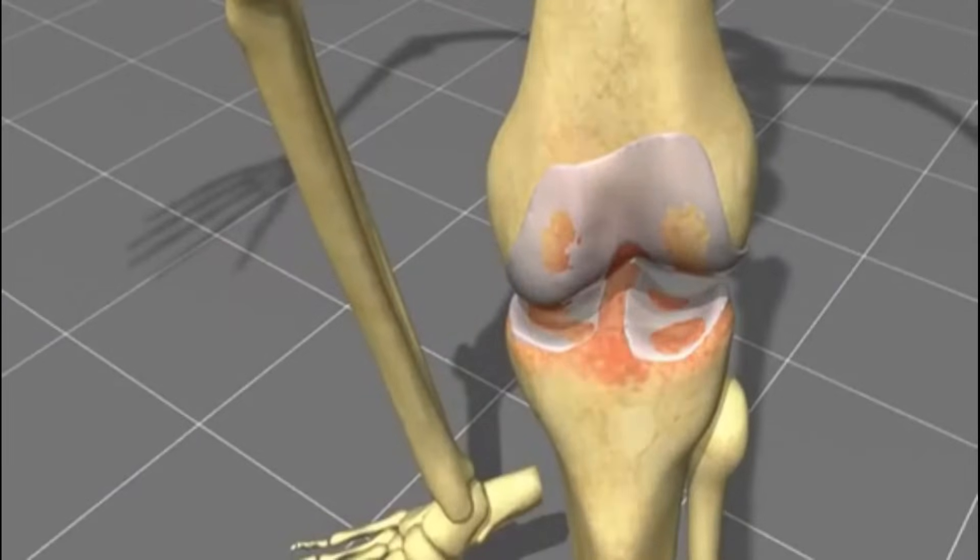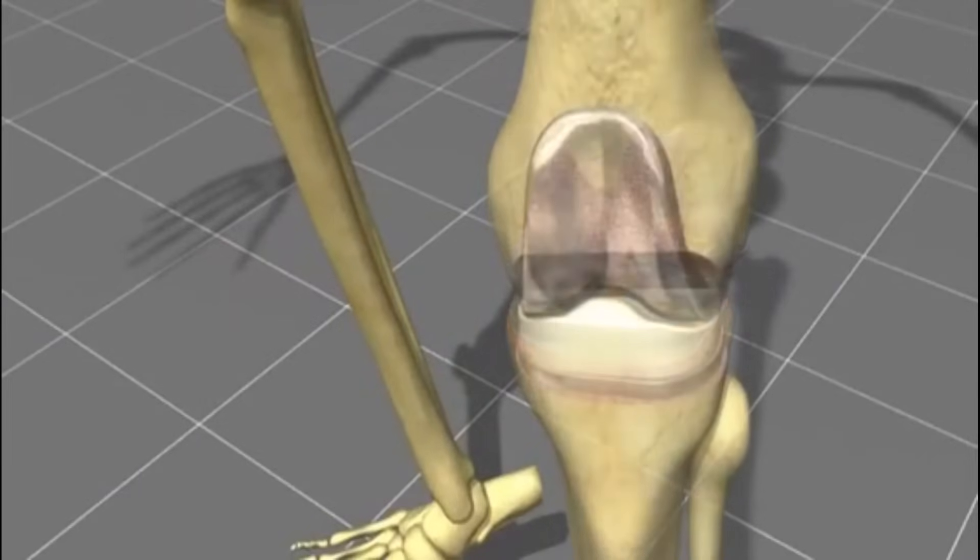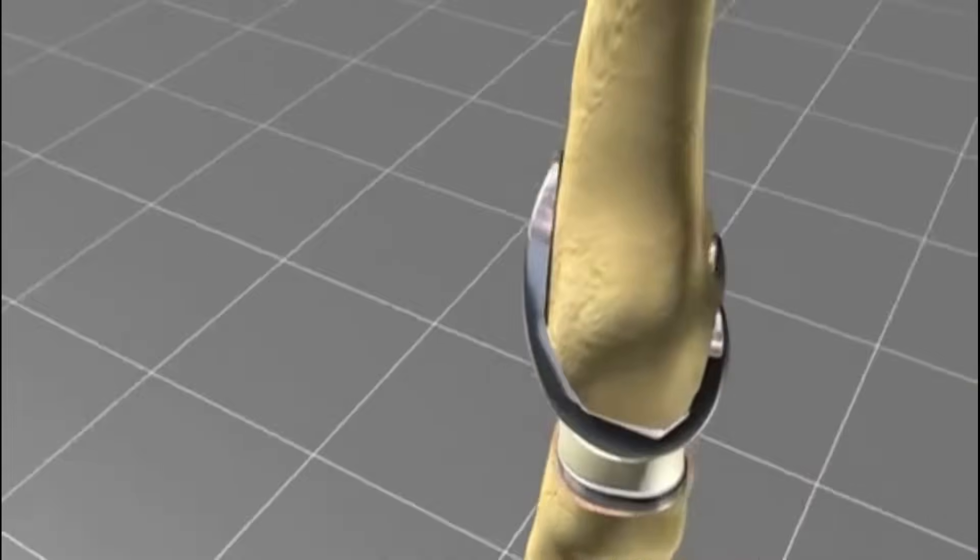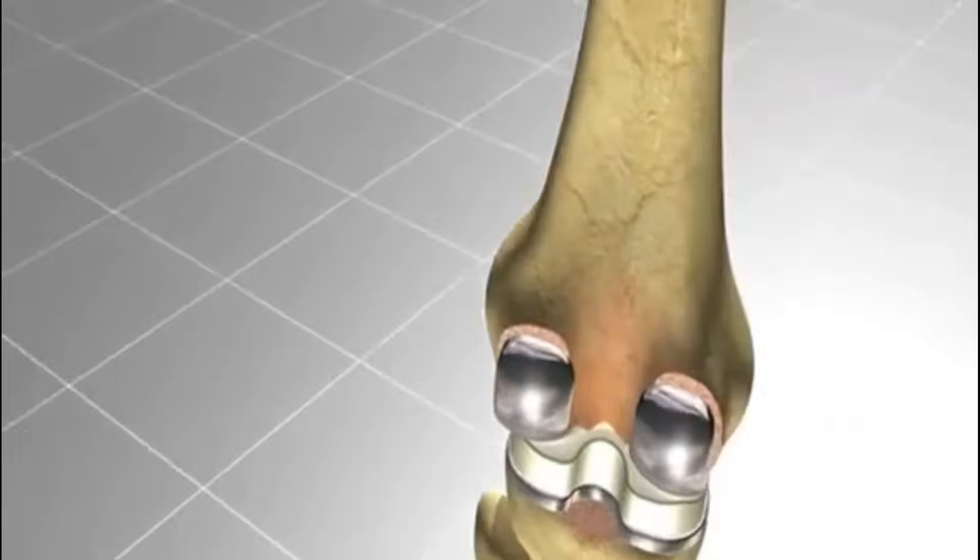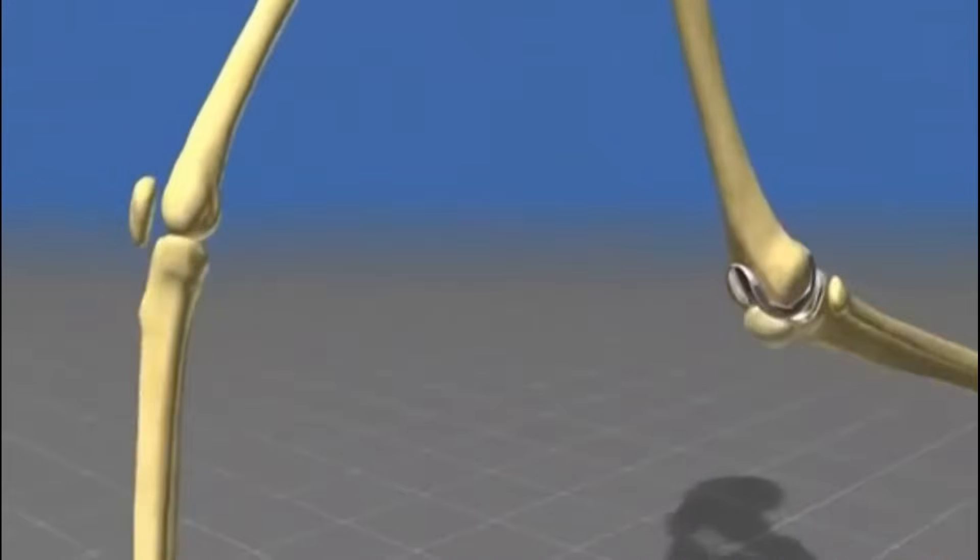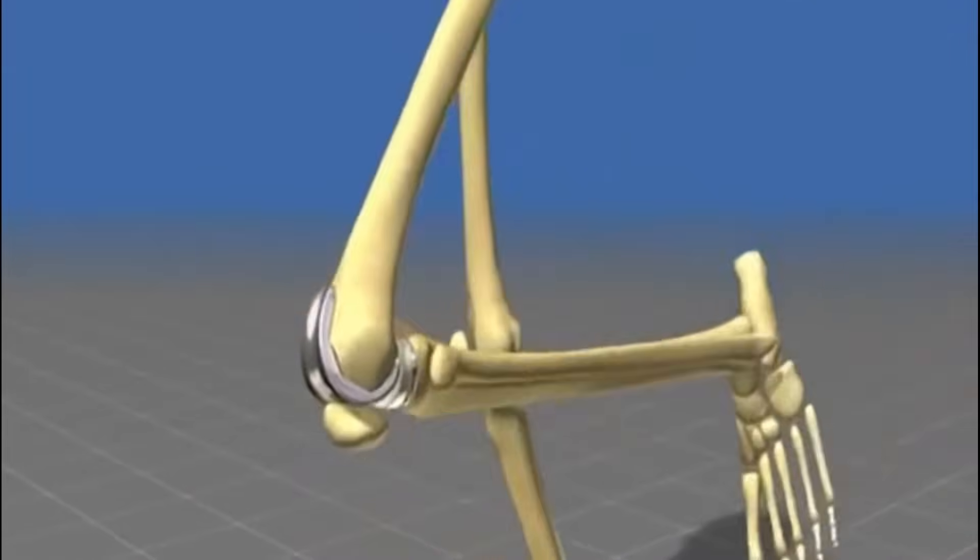In this situation, the only solution for the patient is a so-called total joint replacement. Modern total joint replacement does not mean that a total joint is replaced. Only the damaged cartilage surfaces are replaced by an implant.